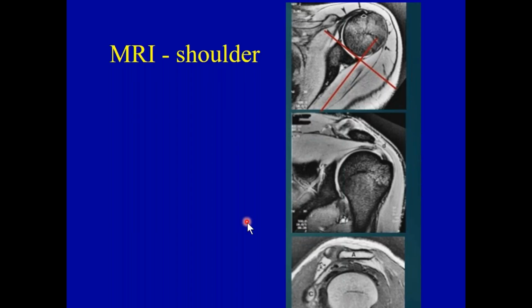I'm just showing you an example of shoulder MRI, because if a patient has rotator cuff injuries and there is the suspicion of a rotator cuff tear, the plain film radiograph doesn't really help in that sort of diagnosis. The nice thing about the shoulder x-ray, from a technical perspective, is that it doesn't cost very much. So let's say, just for argument's sake, we're doing a routine examination of the shoulder and it's billed out, the technical component is $100.